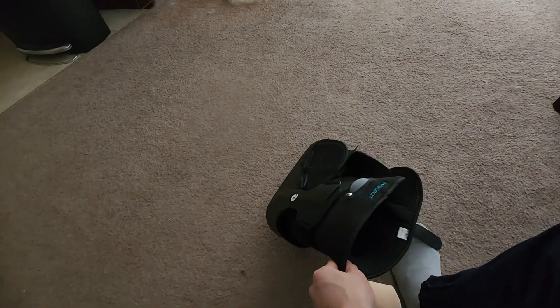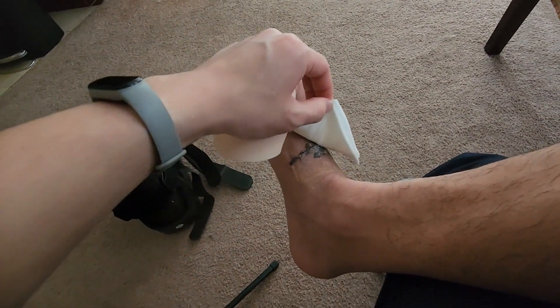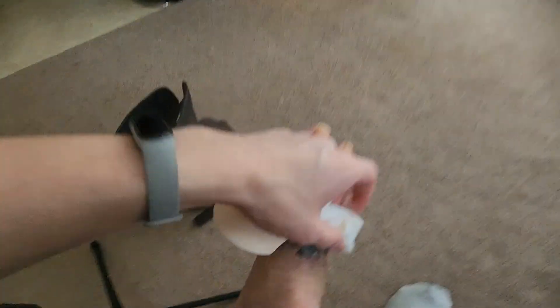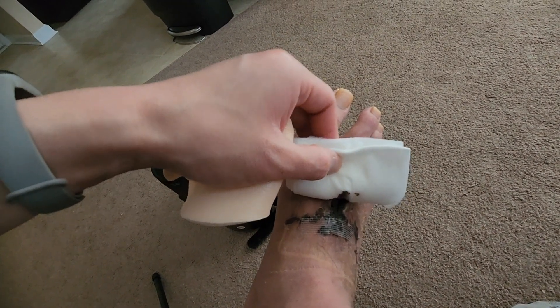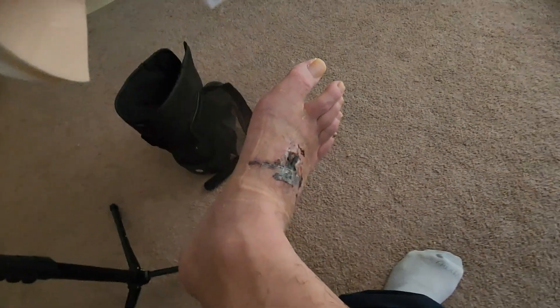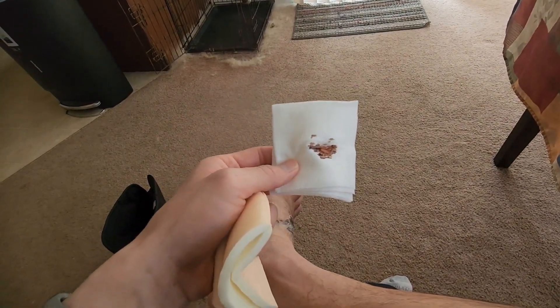The heel pad has been helpful — fortunately, my pressure ulcer on my heel has been getting better. I'm mainly using it now for comfort when wearing my boot, since it doesn't have enough cushion. Now I'll remove the old dressing slowly, because pulling it off too fast can remove the scab formation and make things worse. You can see the wound here, and this is what happens when you don't use non-adherent gauze — parts of the scab come off during dressing changes, which delays healing. Don't make my mistake.